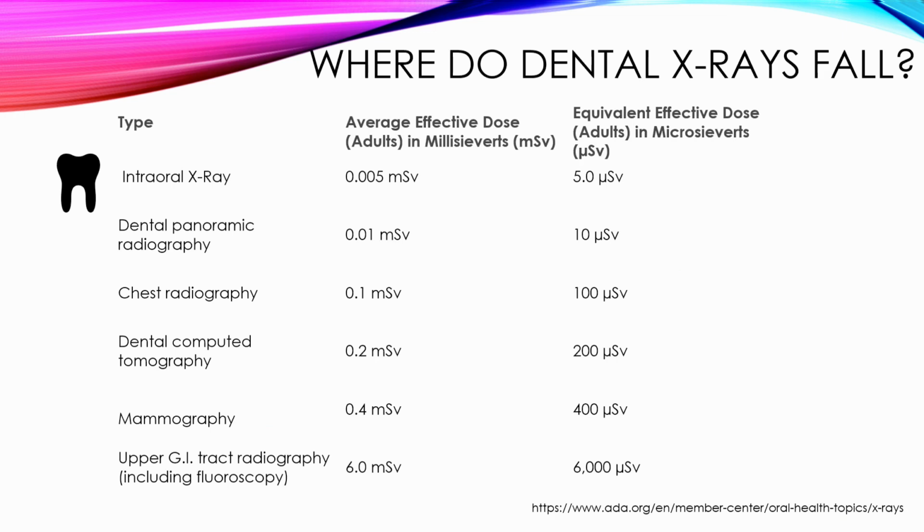If you have a doctor that wants to operate on your back and asks to take an x-ray, you'll probably allow it. You want to do the same thing for a dentist. Do you want a dentist drilling on a tooth without seeing how far the decay goes or how close it is to the nerve? It is your job as a dental assistant radiographer to educate your patient.